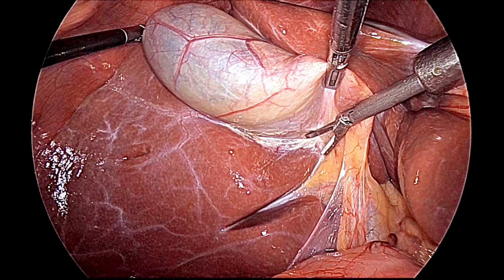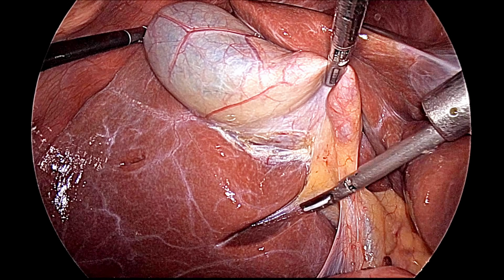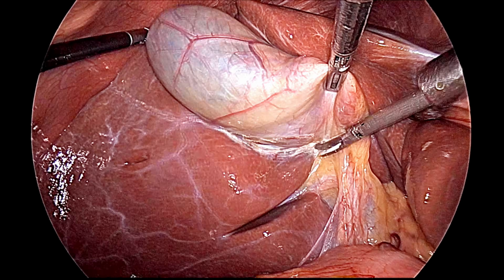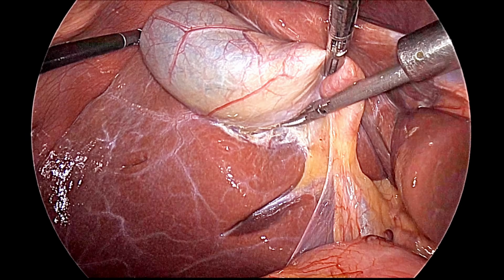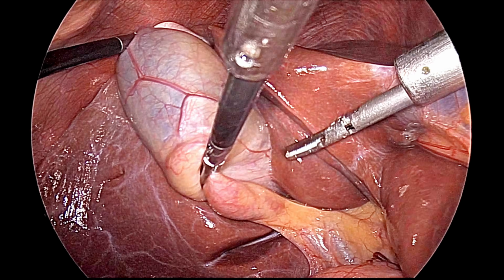And all our dissection must be above the Rouviere's sulcus. And this is the porta hepatis, can you see? And this is the Rouviere's sulcus. So, Rouviere's sulcus is separating the right lobe of the liver from the caudate lobe of the liver at the level of porta hepatis. So, this is the posterior peritoneum being dissected.